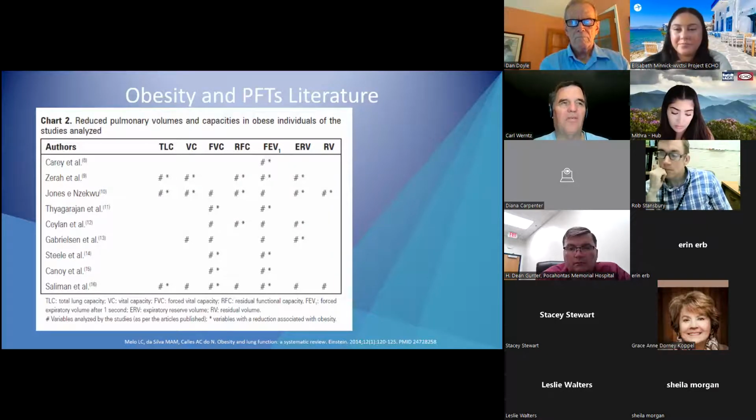Yes, what he was doing was consolidating opinions. And one of the things that's really hard is it's in a lot of the literature. I'm going to call this specialty literature, meaning that it's obesity within spirometry. Everybody does it a little bit differently, for probably some slightly different purpose.